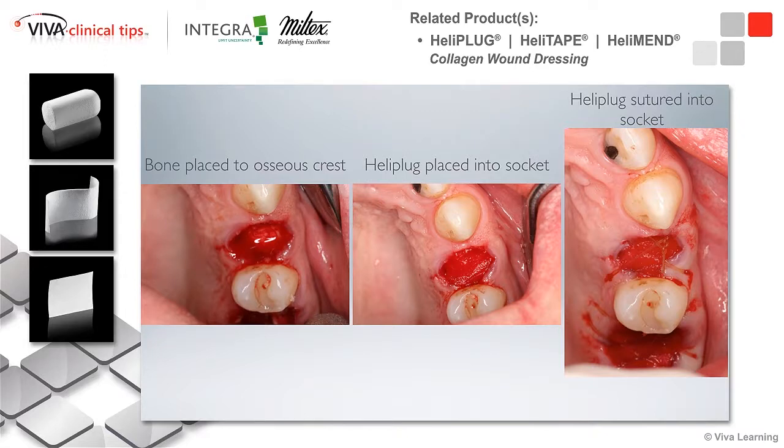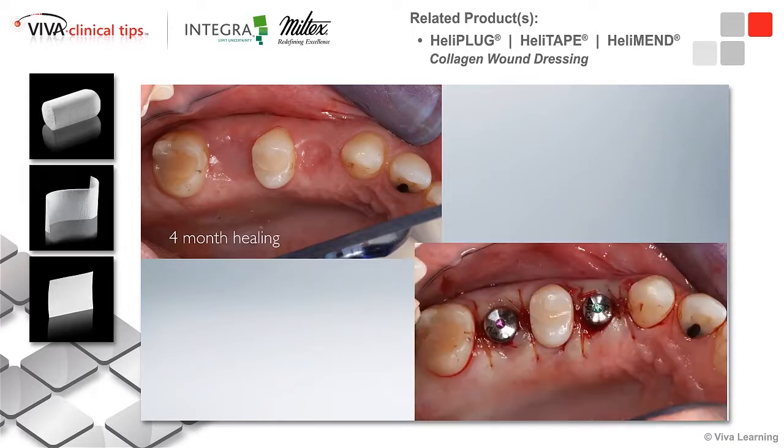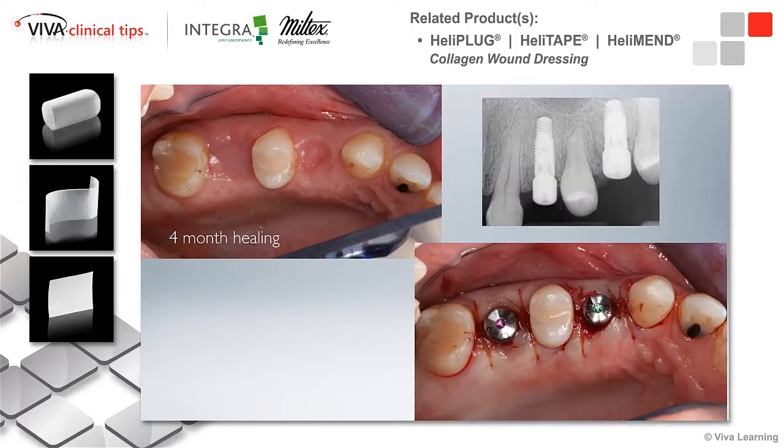And then we go through all the steps of healing that we talked about last time as the epithelium closes over the top of the new granulation tissue. At 4 months healing, we can see a nice sealed up socket, indentation in the middle where the middle of the socket is, but the epithelium has closed over, and we have new bone underneath that has grown in. Then we're able to place our implants into our new regenerated bone from the socket bone graft.